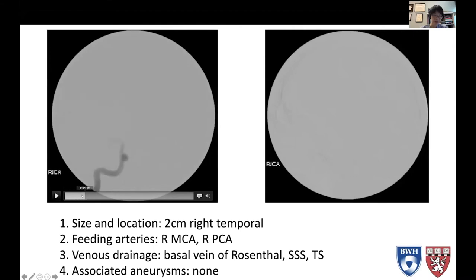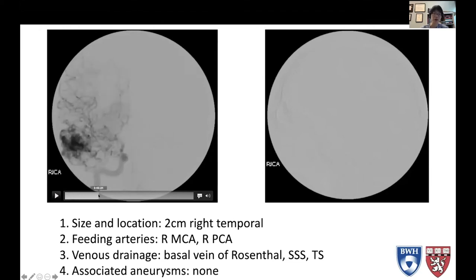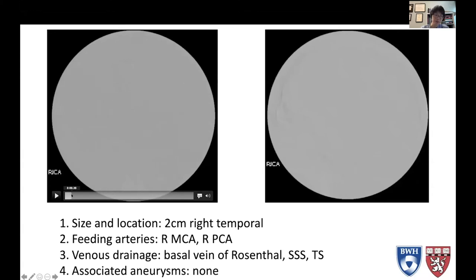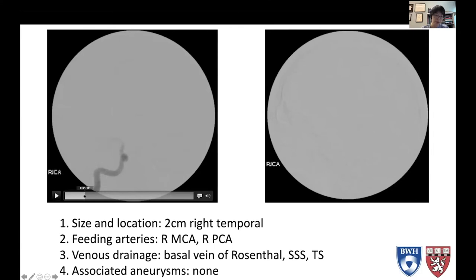This is a video of the angiogram — a right internal carotid artery injection in the anterior-posterior view. The thing to know about an angiogram is that it's basically a movie. You start in the arterial phase, where you see the internal carotid artery going up. As the movie runs on, here are the middle cerebral arteries feeding the AVM, which is this tangle right here. So you see the AVM in the arterial phase.